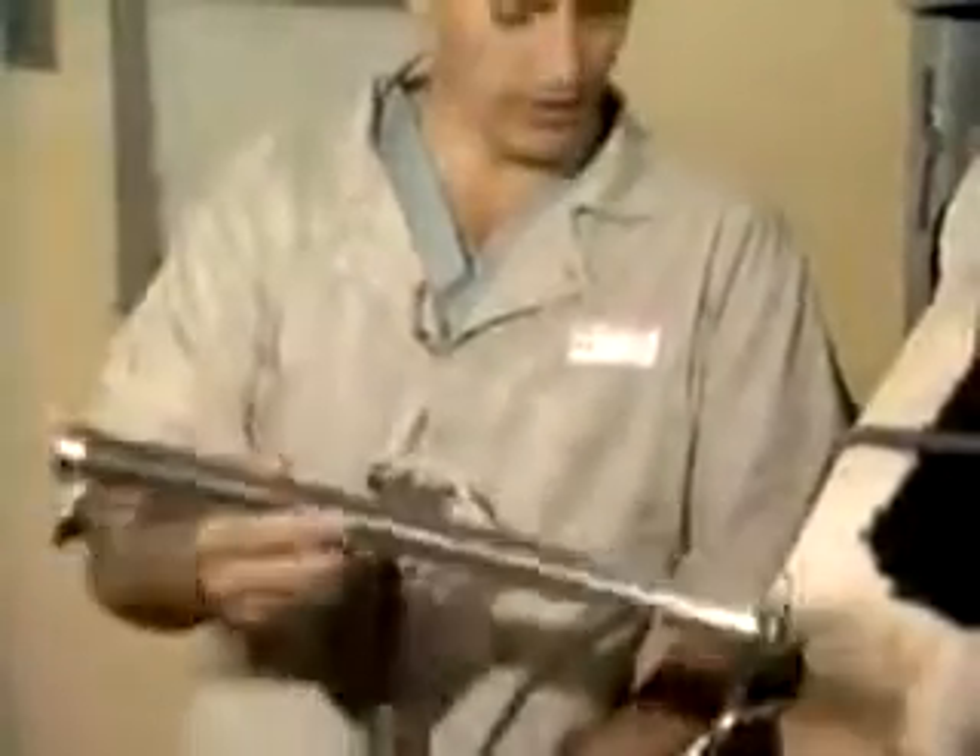This tube — a length of metal tubing — keeps the cow from chewing on the stomach tube. The only difference with this version is that it has a strap on it that helps you hold onto it so the cow doesn't swallow it.